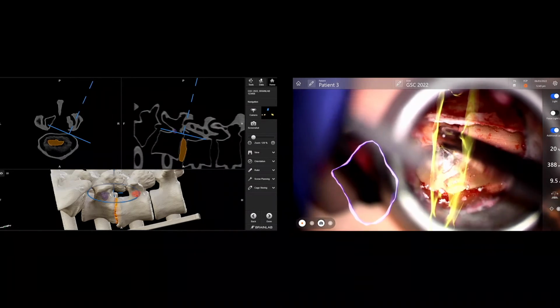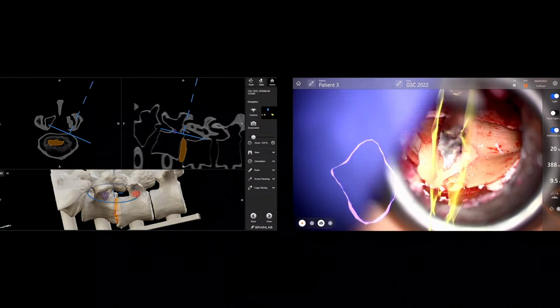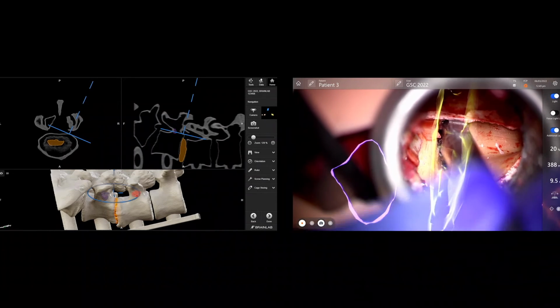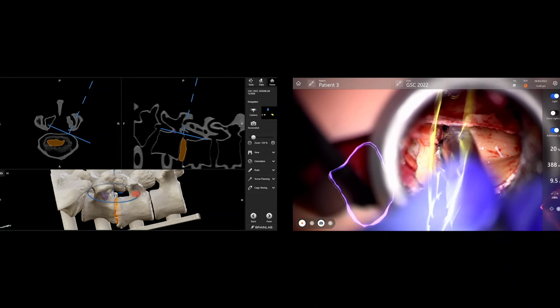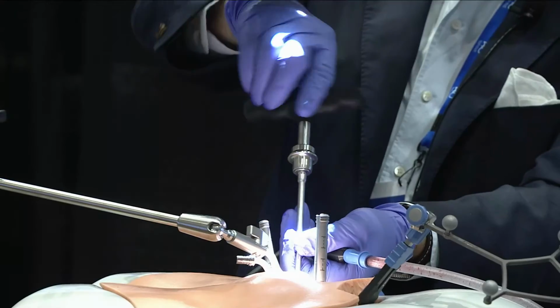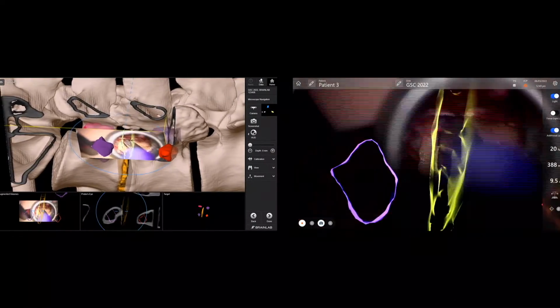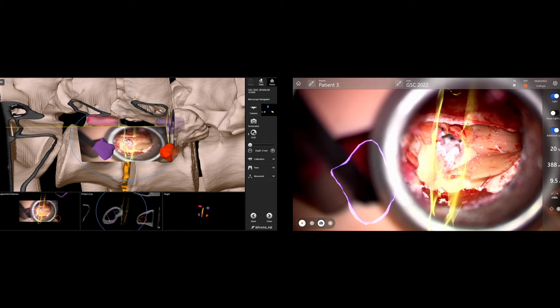What shaver was the last one I used? Yeah, all right, let's get a 9. So we use one more shaver. I think the cage is a 9mm cage, mallet. So we'll go in, handle. You guys are bored watching me do a disc prep.